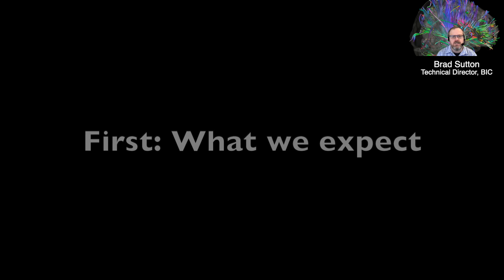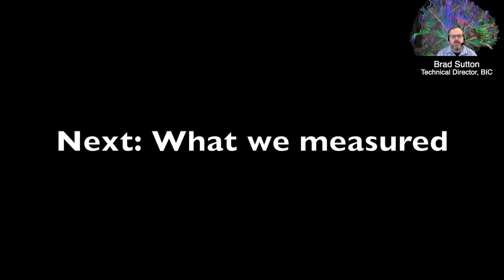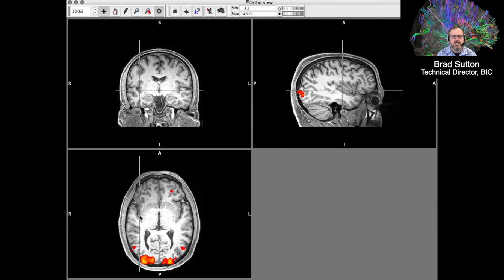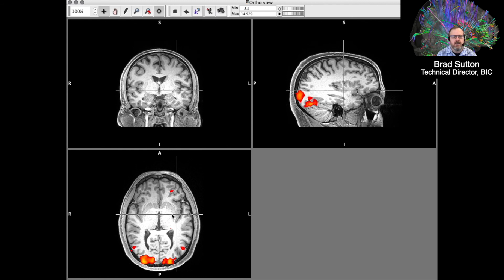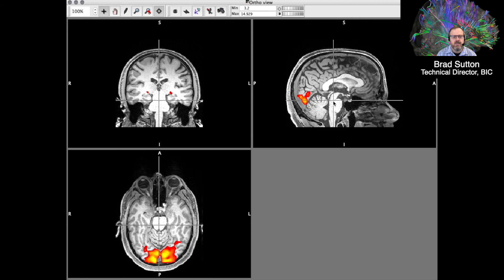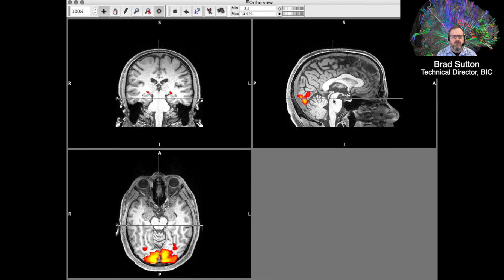Now for the visual task results. Your eyes take in light and project it to the visual cortex, which is at the base in the back of the brain. Sure enough, the flashing checkerboard caused activation in the red and yellow pixels shown here — those are statistical maps showing the Z-score, indicating which pixels increased their signal intensity when the checkerboard was on versus off. For the most part, this is highly localized to the visual cortex at the back and base of the brain.